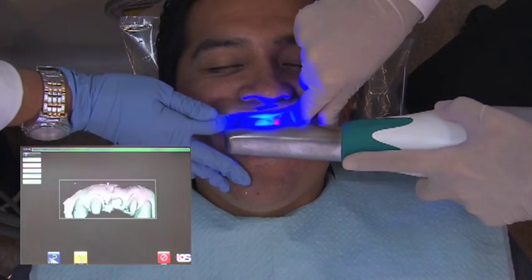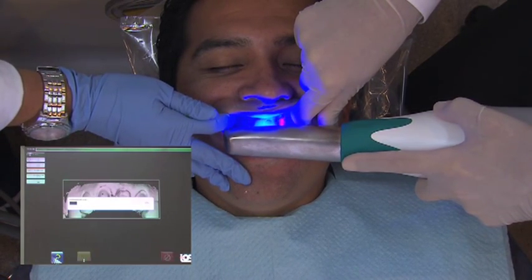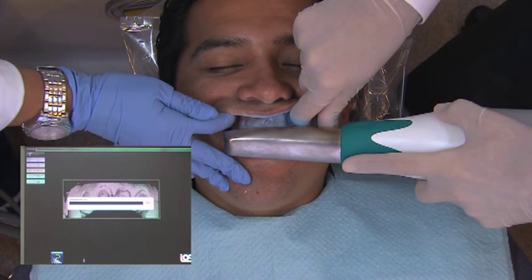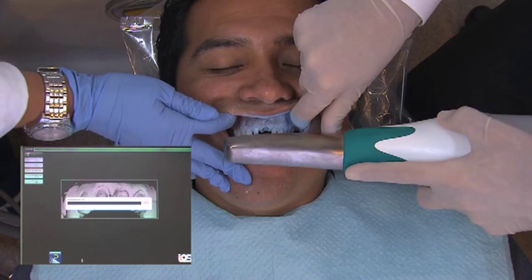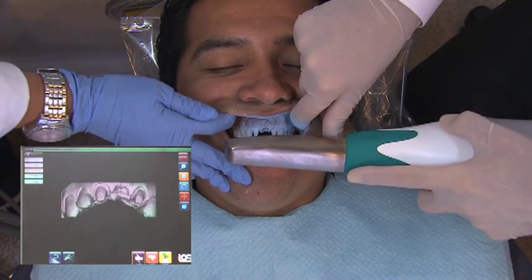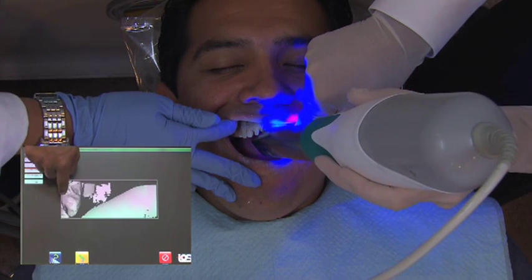It does the whole quadrant for you once you've lined up the wand in the correct position. So this is our third scan. We did an incisal, we did a lingual, and now we're doing a facial scan. From the three of those, it puts them together and comes up with a model pretty quickly, so you're able to see the model and see what your preps look like.